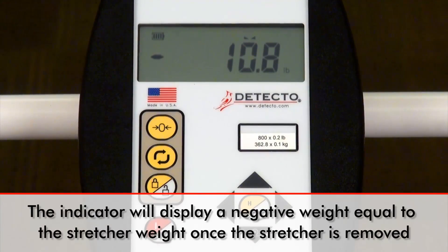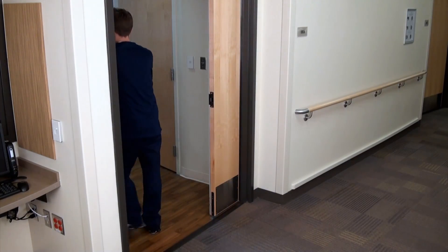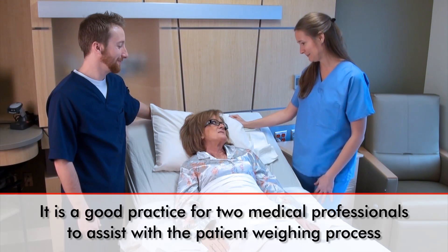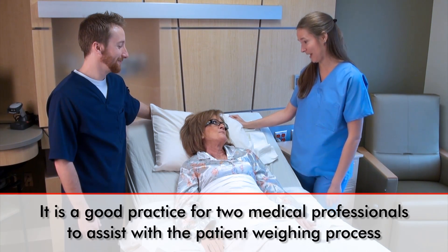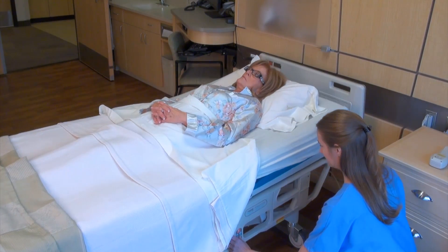The indicator will now display a negative weight equal to the stretcher's weight. Keeping the wheel stance narrow, move the scale into the patient's room. It is good practice for two medical professionals to assist with the patient weighing process. The patient must be lying flat in bed before the weighing process can begin.